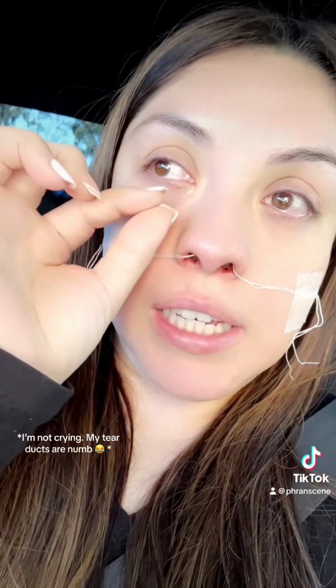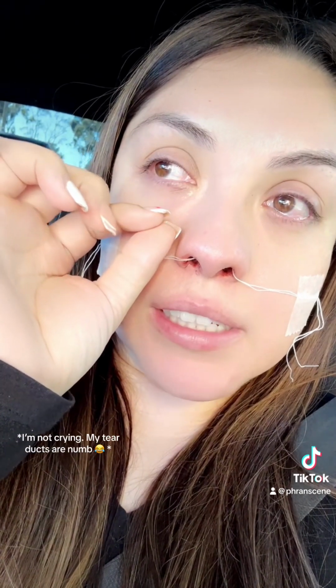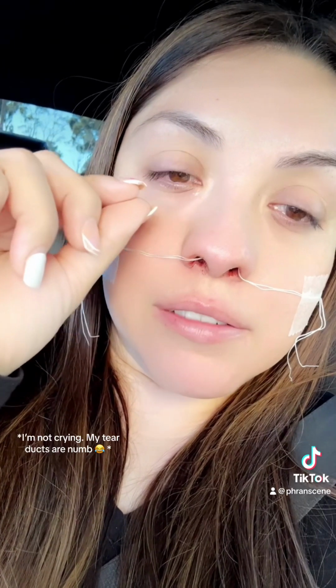He put a balloon in there. It's like a tiny little balloon. Opened up my airway, and he did some scraping and stuff, and then he did the cracking of my nose. I guess my septum was a little pushed to the left, so he put it back in the middle. That was kind of weird.